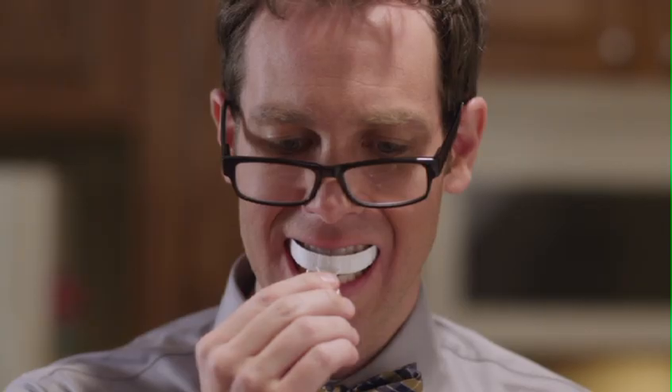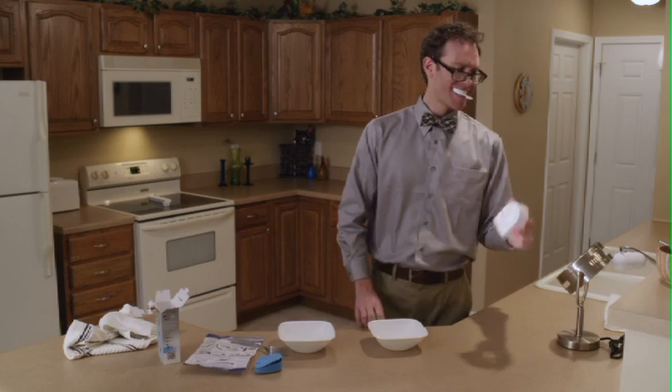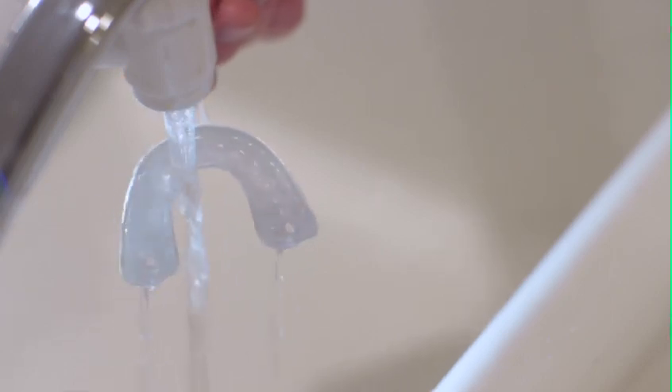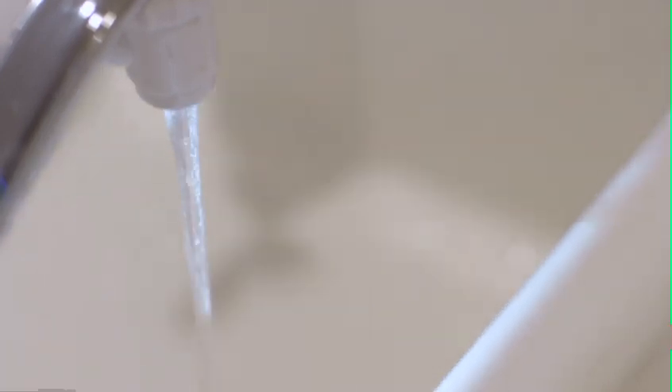While looking in a mirror, center the Dental Guard below your front two teeth and the sides below your molars. Firmly bite down into the moldable material of the Dental Guard and hold until it cools to body temperature. Wait at least two minutes. Gently remove the Dental Guard and custom comfort forming tray from your mouth and rinse under cool water for 20 seconds. This allows the molded Dental Guard to completely set in the custom comfort forming tray.